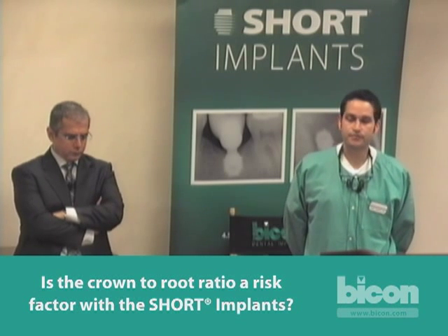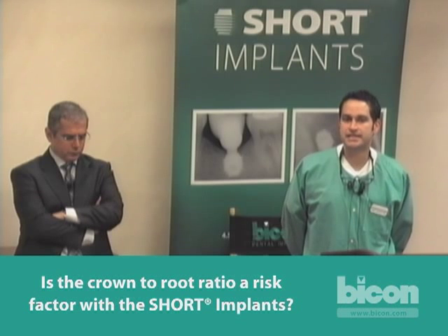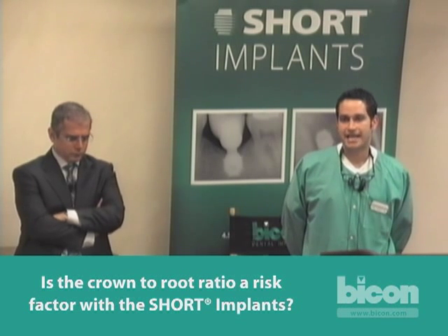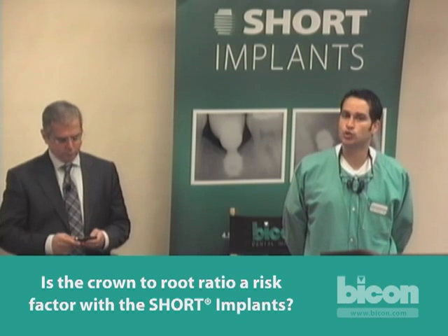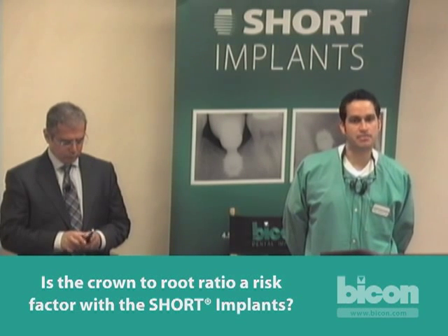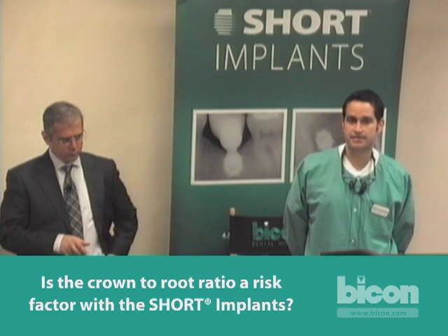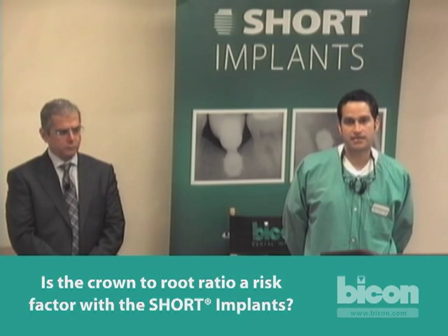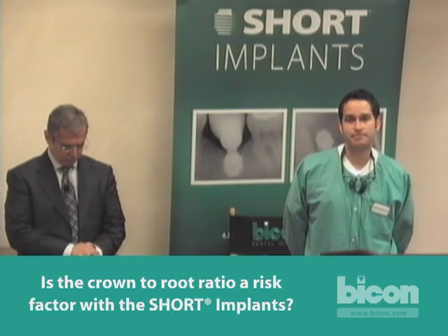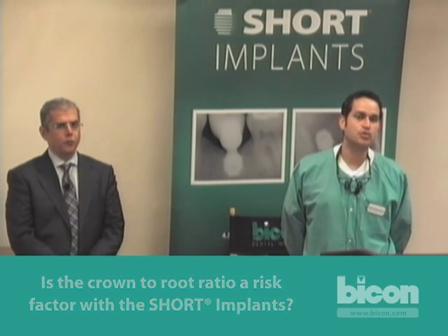One of the reasons we believe strongly nowadays that we lose bone around implants is because we have been using implants that are too long and implants that are splinted — the bone simply dies away or is resorbed as a result of disuse atrophy. Bone likes to be loaded, so a short implant per thread will distribute much more forces to the bone than a longer implant. The biological responses like crestal bone response are actually beneficial. From my own research, a Baikon implant that is 5mm wide and 11mm long is significantly more likely to lose bone than if it is 8mm long — 11mm is simply too long for a 5mm wide implant.